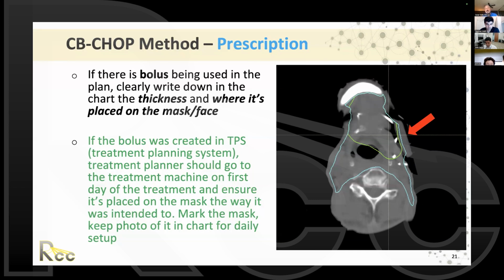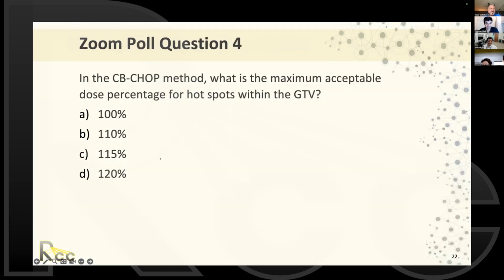Remember, this is going to push the high dose closer to the skin in order to cover what needs to be covered. And if we place it in different areas, we might be increasing the skin dose in areas that we do not want to. Dr. Malik or Dr. Safavi, anything on bolus or prescription? Perfectly agree. Perfect. Awesome.